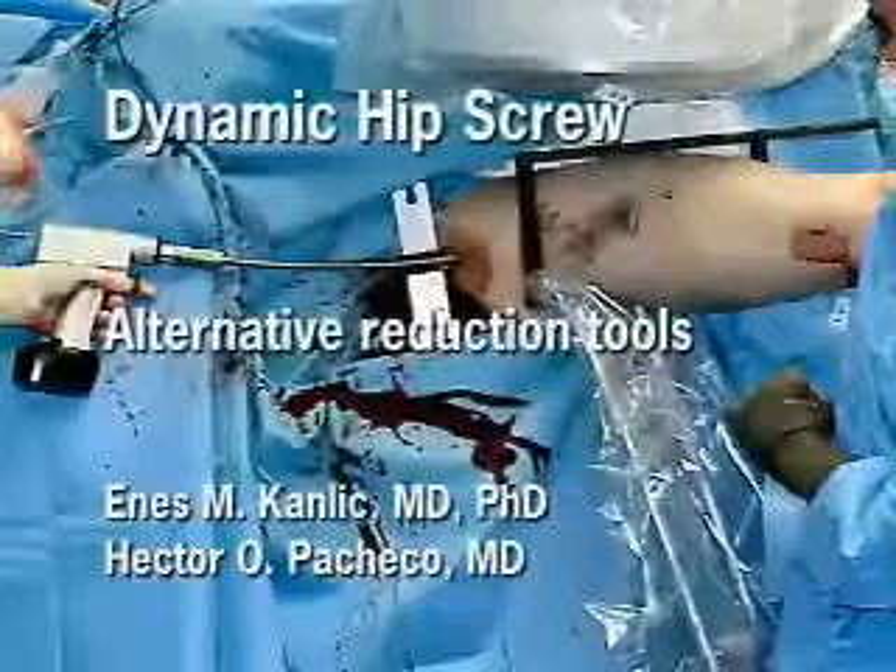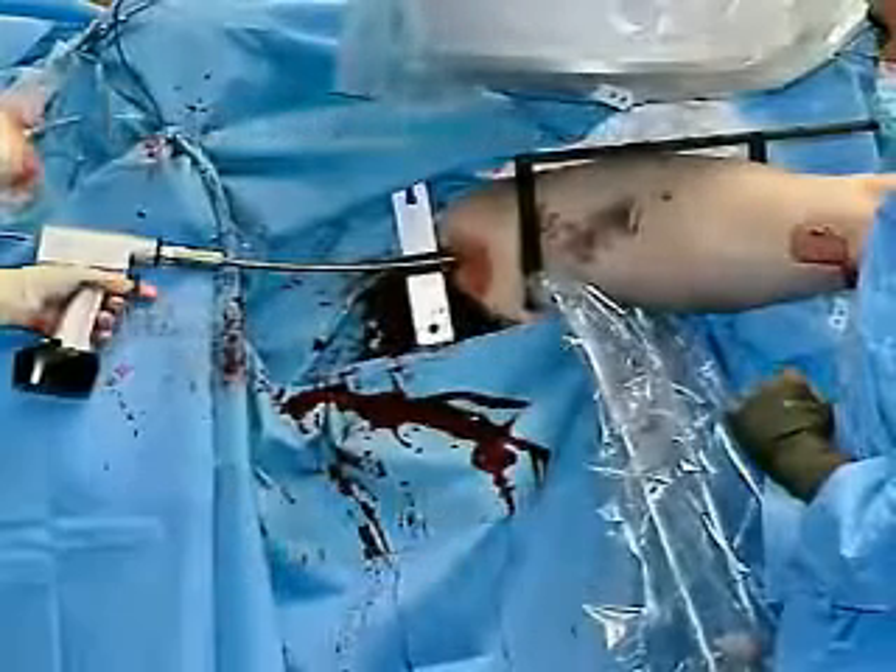Alternative reduction tools: if the fracture could not be reduced as shown, a sterile covered crutch or the F tool could be used to push up.